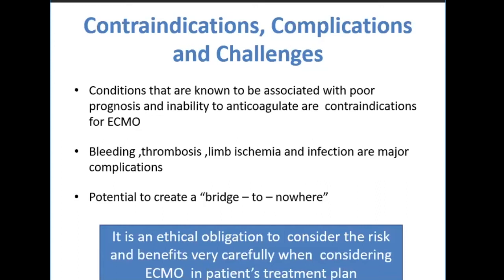Although there are other problems, we can say problems, not complications, like hypoxia and North-South syndrome, and so many Harlequin syndrome. But these can be managed. Here are the limiting factors for the maintenance of the ECMO.